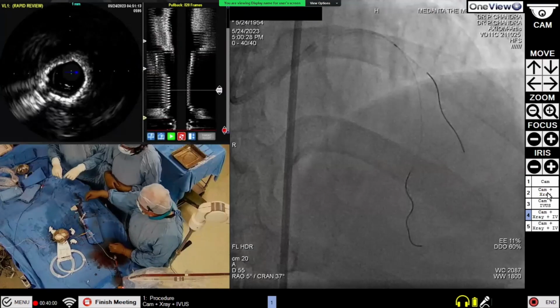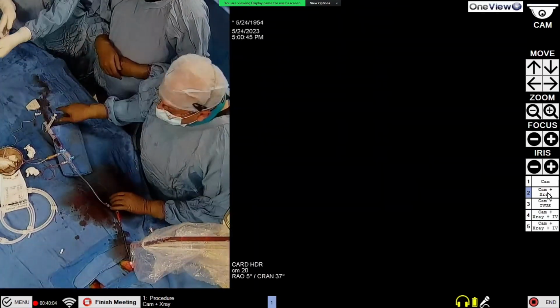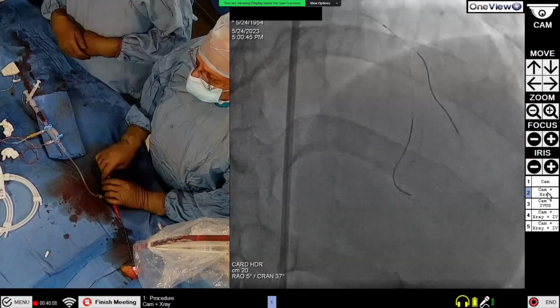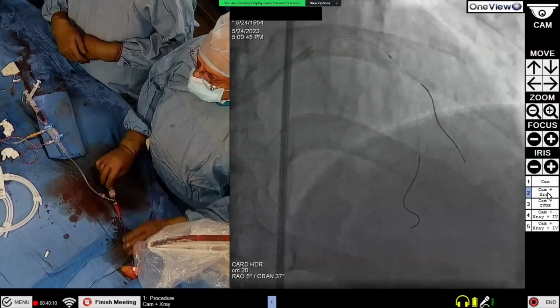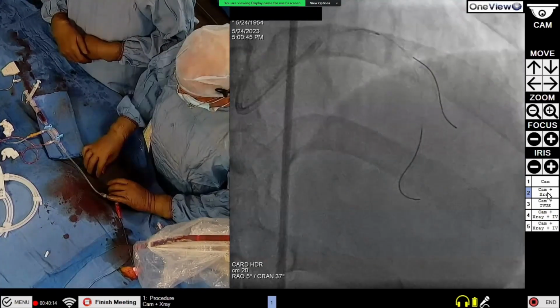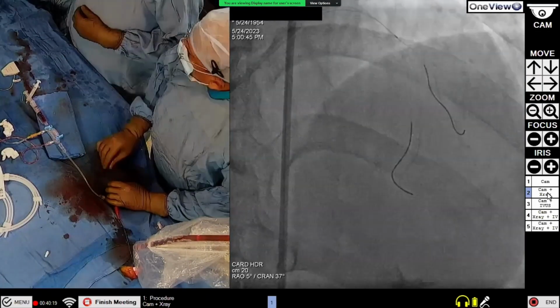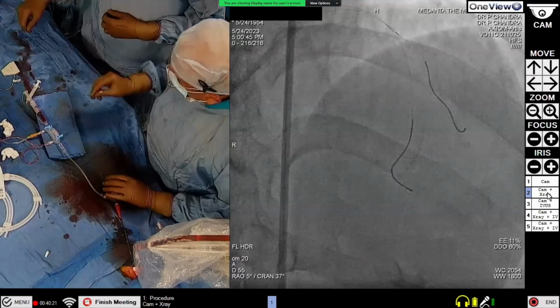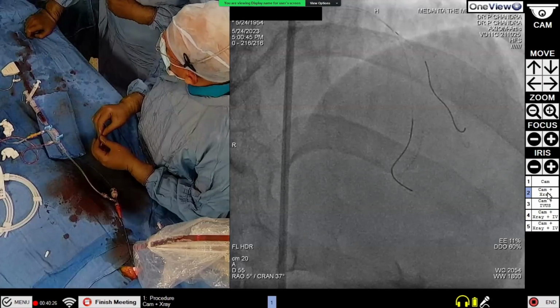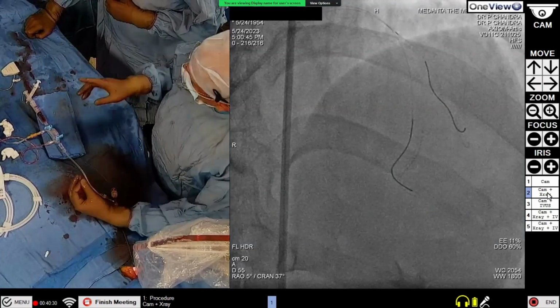Okay. So what size drug balloon are you giving now? For the LAD, three size, and longer. 3.0 by 15 or 20, 3.0 by 20. So we are going to use today a 3.0 by 20, and what? 3.0 by 20 will be better, I think.